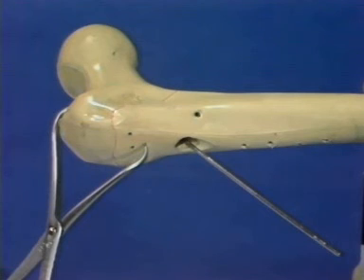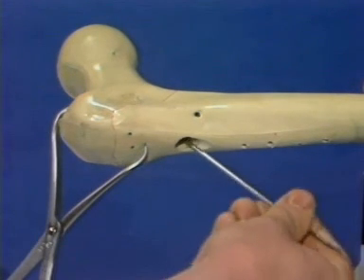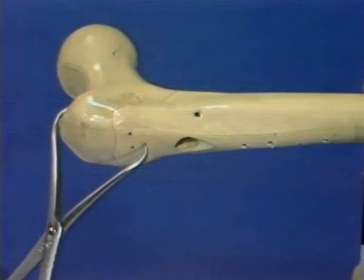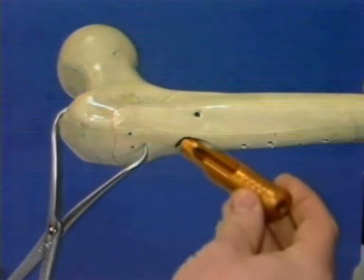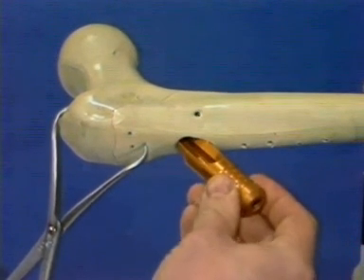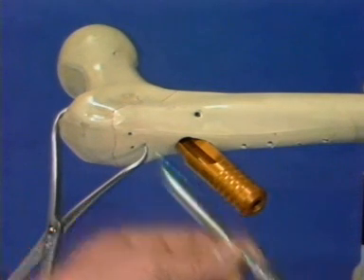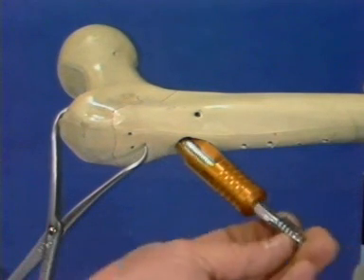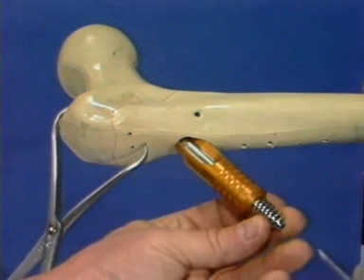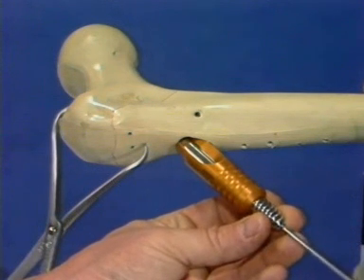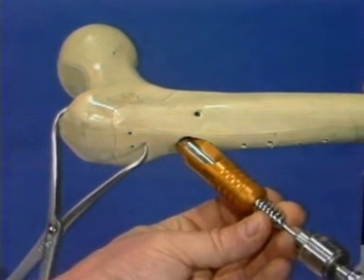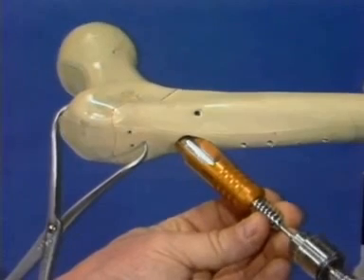Should the guide pin become loose, it must be exactly repositioned, or the screw may not come to lie in the correct position in the femoral head. In order to obtain optimal centering of the pin, the centering sleeve is first placed in the drill hole. Following that, a screw is placed within the centering sleeve. The guide pin can then be re-drilled in this way into the exact center of the previously made tract.